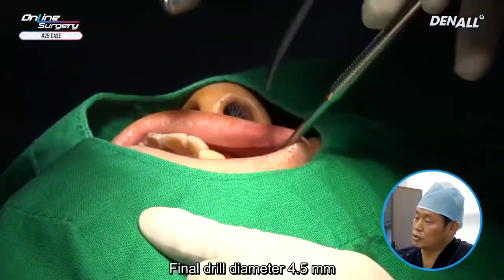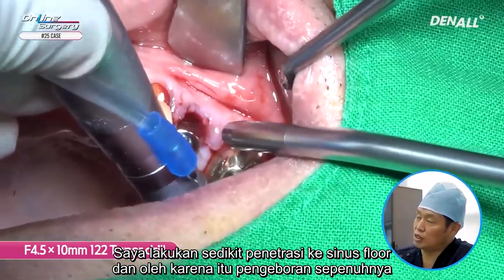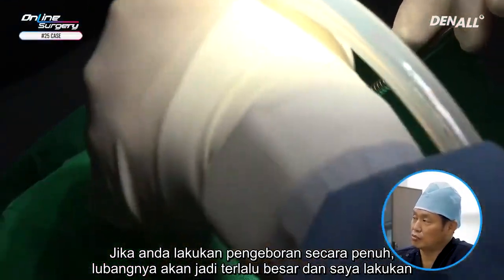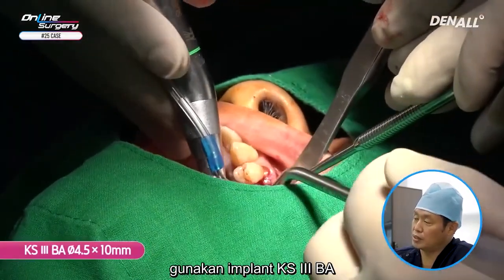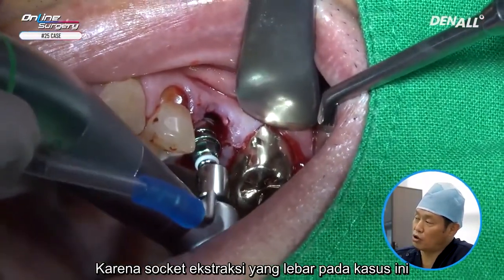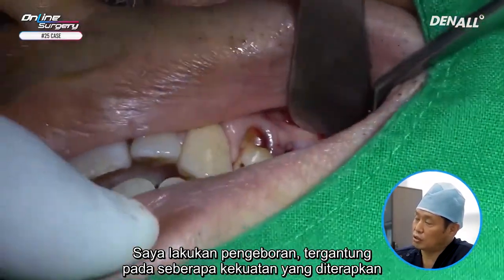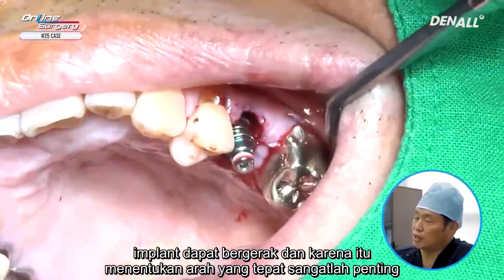The final drill is diameter 4.5. I slightly penetrated the sinus floor and therefore full length drilling was not done, for primary stability. If you drill full length, the hole can become too big, and I just did it so that it is slightly penetrated. Here, a 3BA implant was used for implant placement. Because the extraction socket is wide in this case, I did drilling. However, depending on how much force is applied, the implant can move, and therefore finding the right direction is very important.